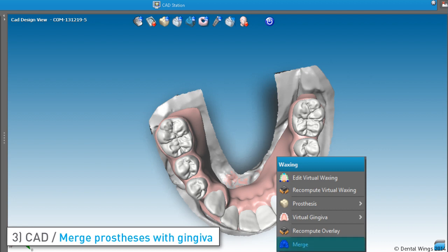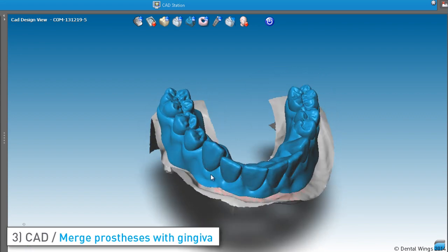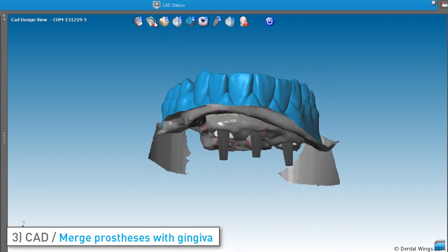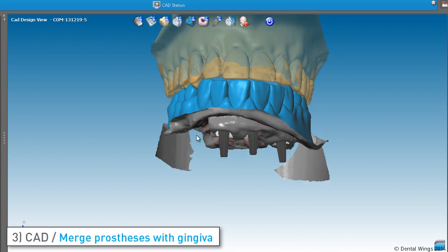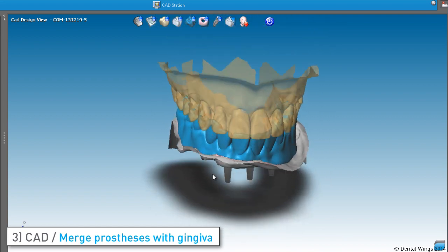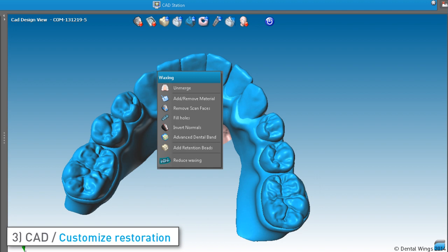Once the anatomies and gingiva are merged, the result is managed just as a waxing that would have been scanned. You know they are merged because the new element appears in blue, just as the traditional waxing does. Merging is always reversible, thanks to the Unmerge function.